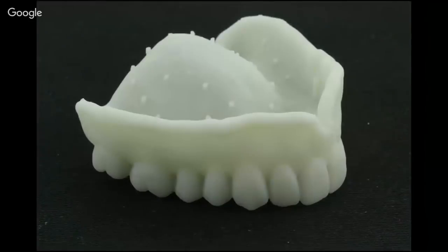Here it is. I know I put supports internal. This was what I was talking about earlier. If you print with supports and you have the intaglio oriented toward the print bed, you're going to have to go in and clean up all these little resin tags. This is a demo case, so I don't care. All right, so again, nice looking denture, nice looking teeth shapes and everything, but it's monolithic.